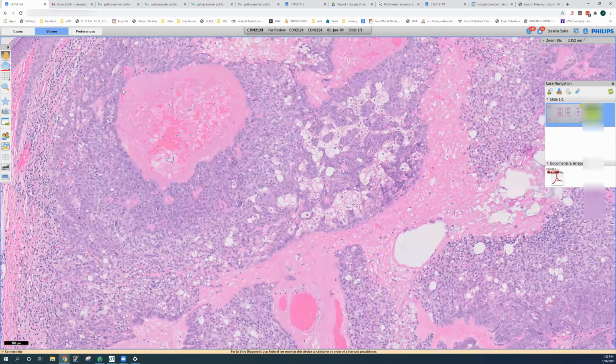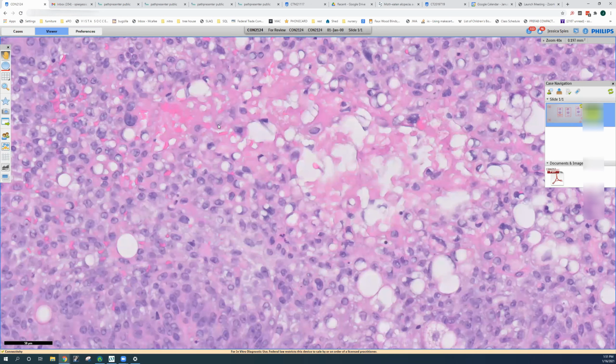And in other areas, there's tumor necrosis. Let's see here. It's kind of not quite there. This could be considered some tumor necrosis, probably. Let's see if there were other. Here's tumor necrosis with all this pink material, hemorrhage.